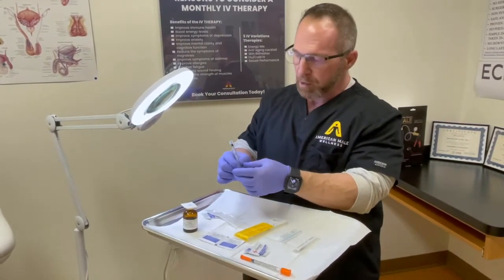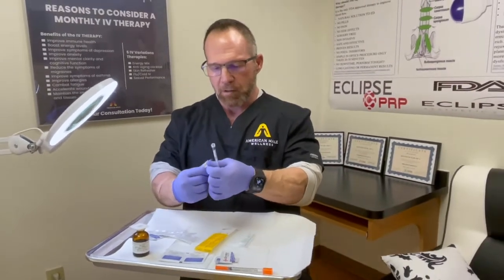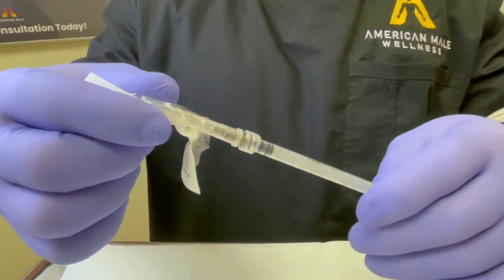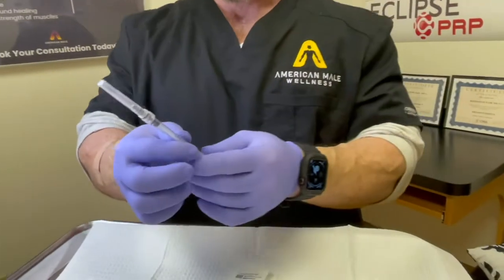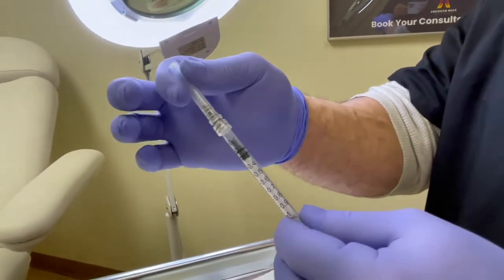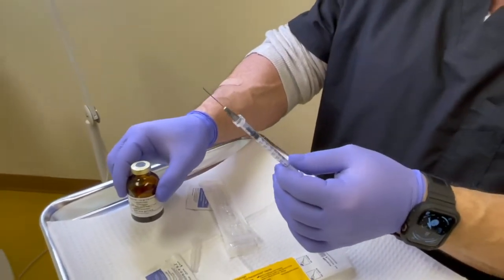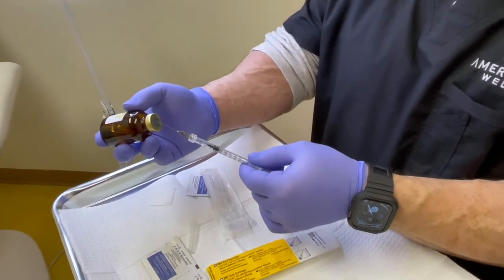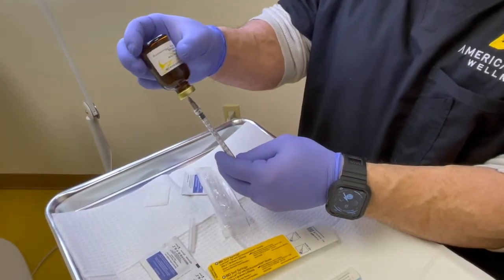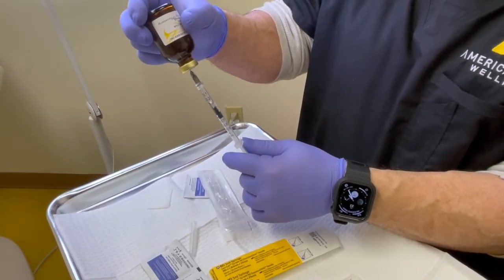Now I take the 22-gauge needle, open it, and screw it onto the luer lock. I pull back the plunger a little bit, take the cap off, clean the top of the vial with alcohol, insert the needle into the center of the vial, and push that additional air in. Then I pull back on the plunger and watch it load.